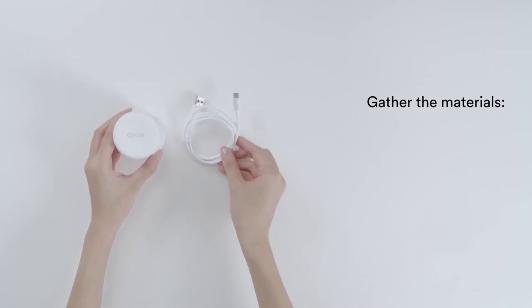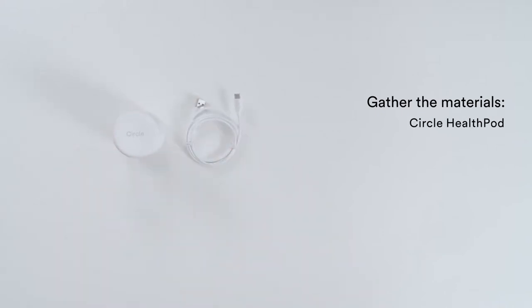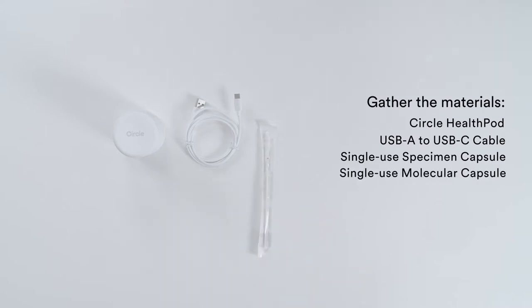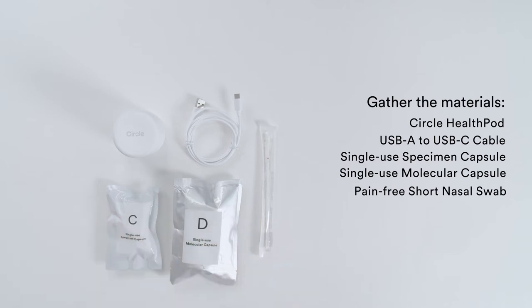Gather the materials needed for the test, which consists of the Circle HealthPod, a USB-A to USB-C power cable, a set of single-use specimen molecular capsules, and a pain-free short nasal swab.